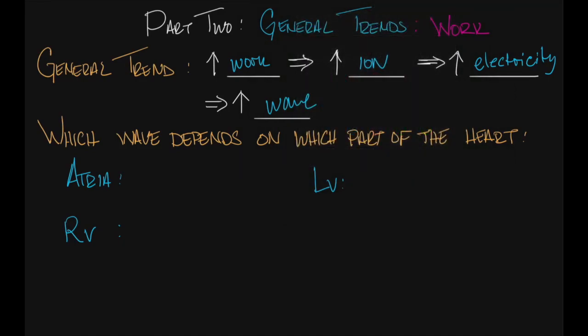And we can see that different parts of the heart have characteristically different parts of the EKG that show themselves when the electrical vector is shifted in that direction. So for instance, if we have an increase in the amount of atrial activity, then we typically notice an increase in the amount of P wave presence. And that could be P wave height or P wave width.